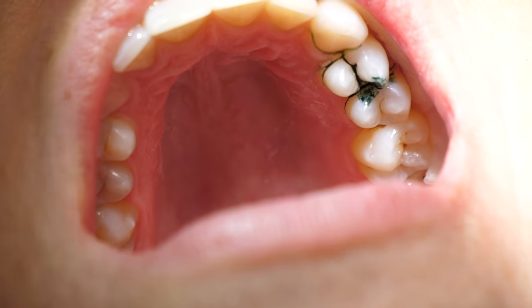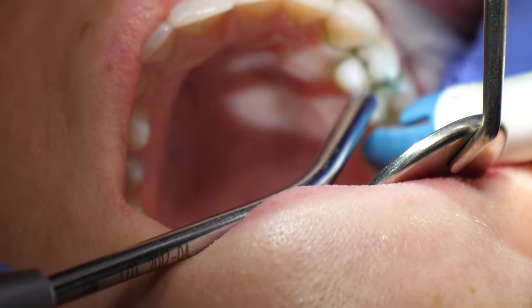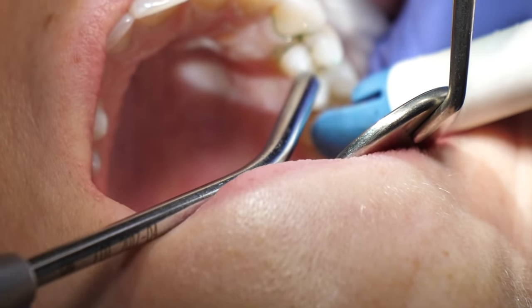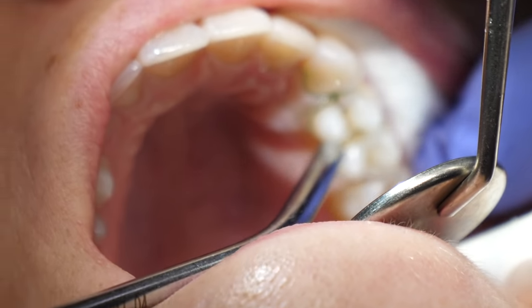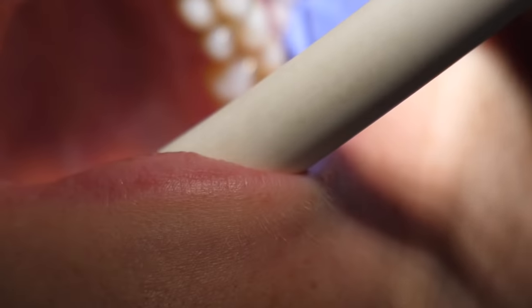Now, this green liquid that they just placed on the tooth is a cavity detector liquid, or also called a caries finder. It can help see exactly where any residual cavity is, but sometimes it does get on the gums too. So if you're like, what happened to the patient's gums? It will rinse away later.